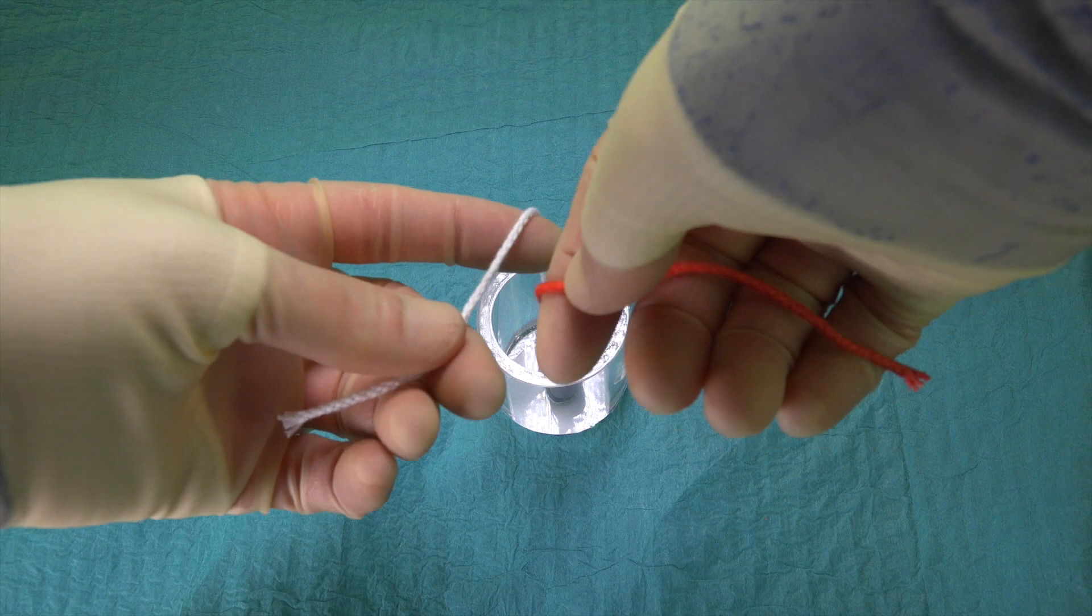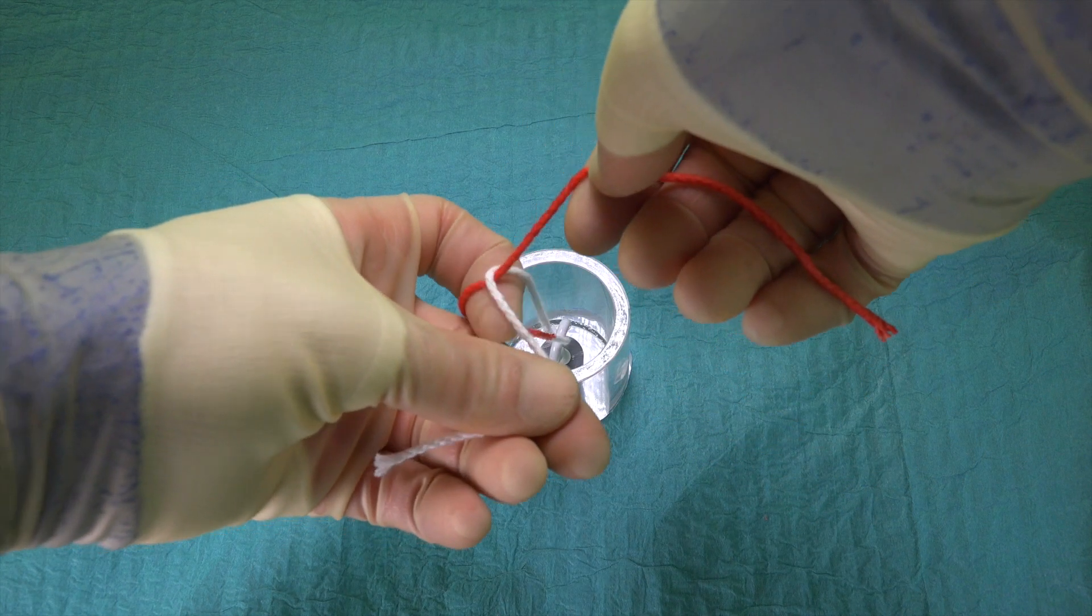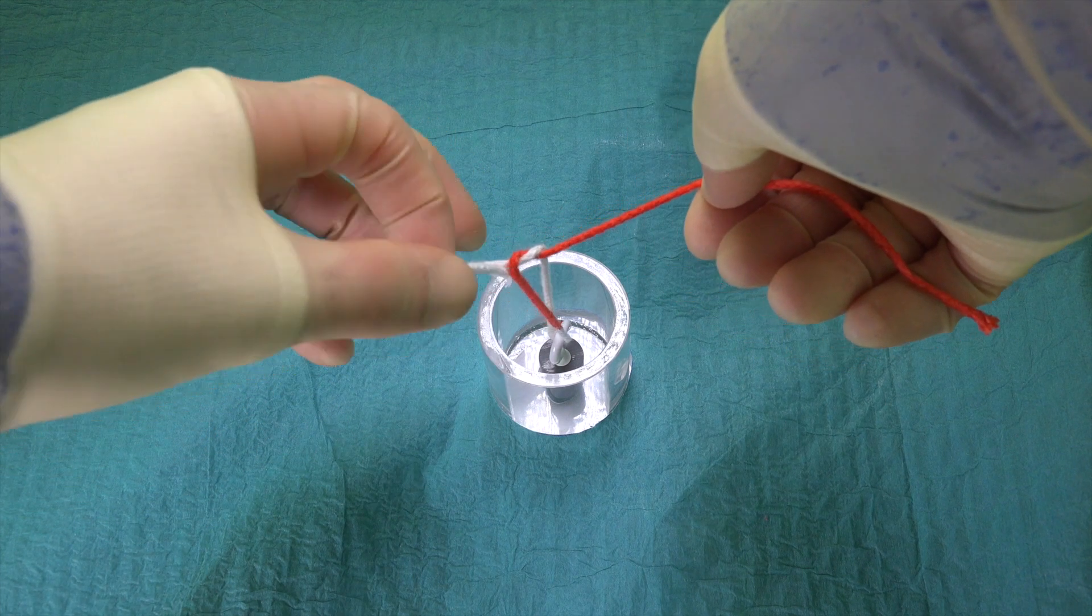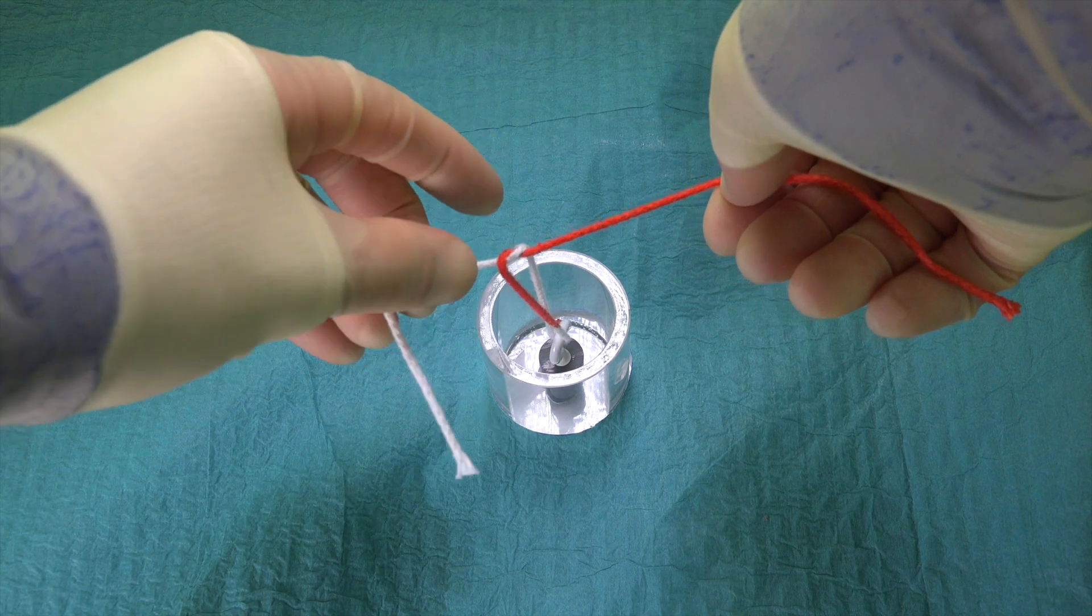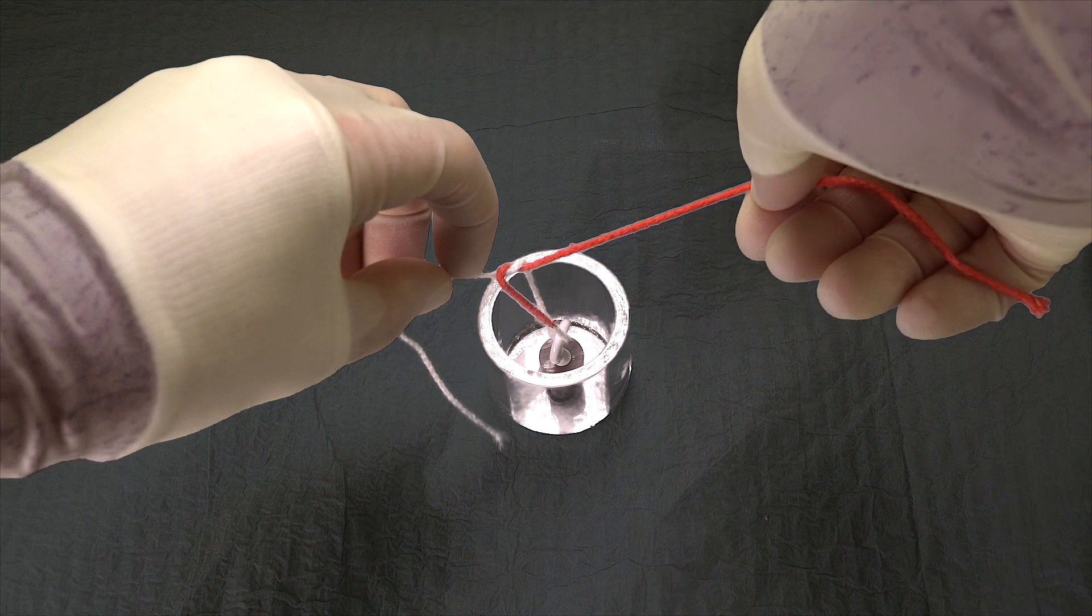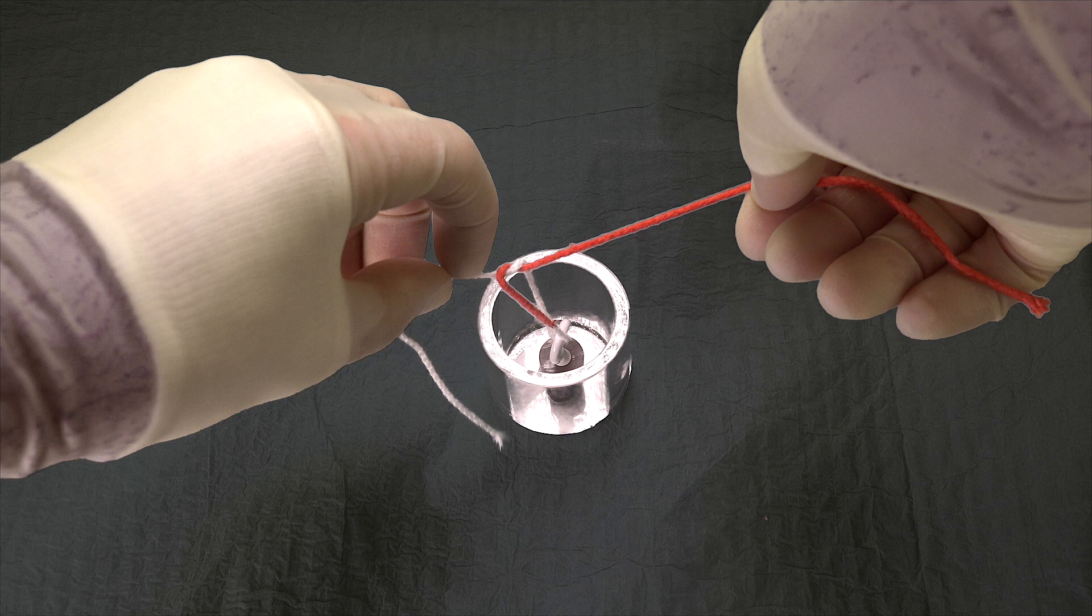We perform the first throw of the reef knot using the same movements as we would for a normal hand-tie. But, rather than the hands crossing at 180 degrees to lay the throw down, the right hand moves away from us slightly, but then maintains its position whilst pulling slightly upwards on the suture to maintain some gentle tension.